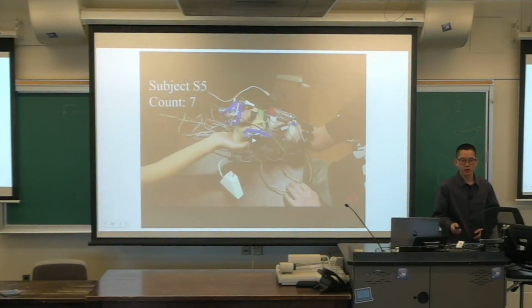Yeah. I think there has to be a lot of work to achieve this, both on the hardware side and the software side. On the hardware side, you have to make sure your ROS packages are communicating well, and they are sending messages at a fast enough frequency. And on the software side, we have to make sure that the inference time of the algorithm is fast enough. That's why, when we talk about the choice of candidate classification algorithms, we rule out neural networks, because the inference time for a neural network is much longer than LDA. So then you will see a much longer delay. But this is using LDA. We intentionally choose LDA because it's fast.